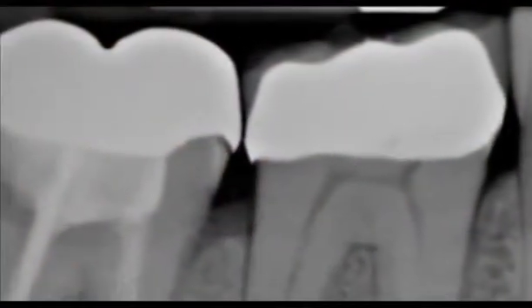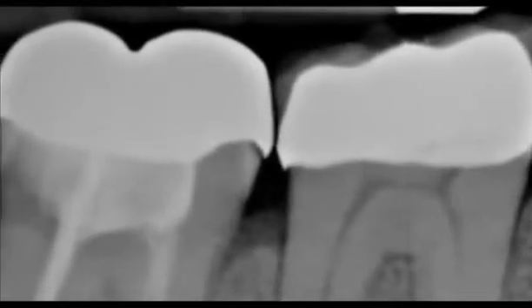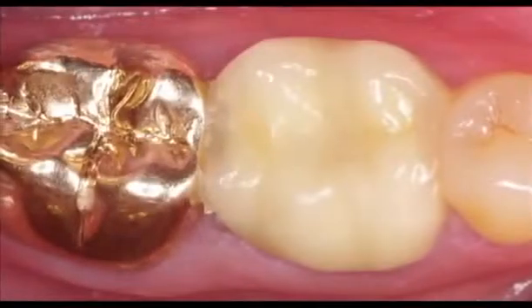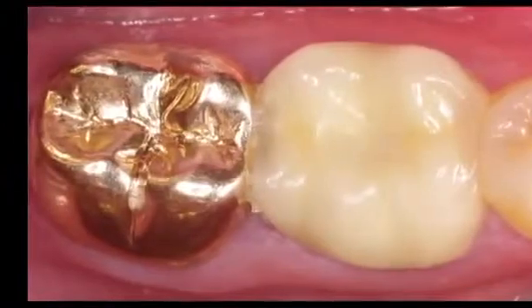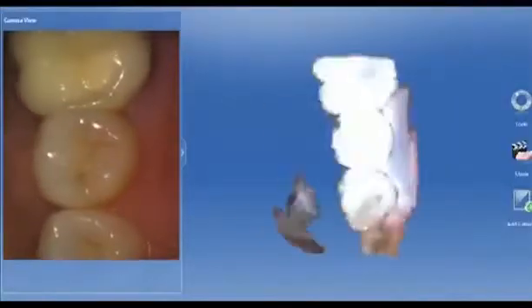We begin by finding an open margin on a routine bite wing x-ray of a gold crown. It looks pretty straightforward. The gum tissue looks nice. Obviously you can see a gold crown. The mesial margin is open. There's a large buildup, and it looks to be a small post here preoperatively. So we inject the patient.